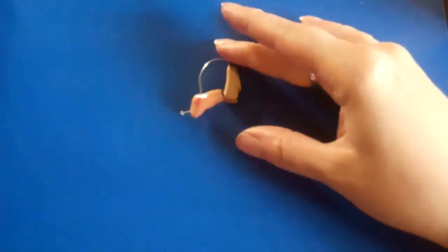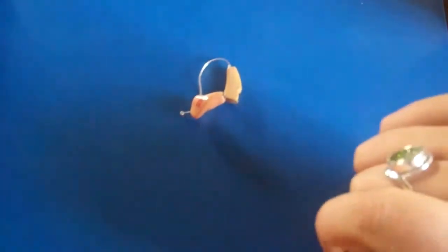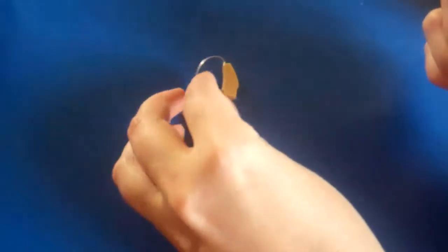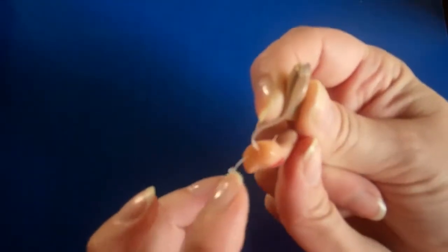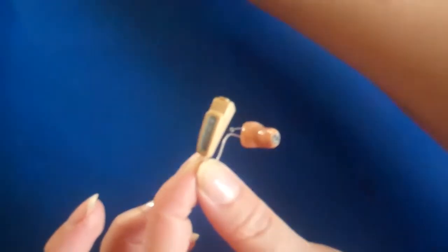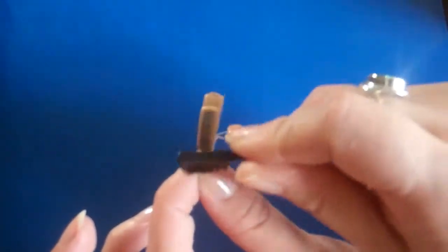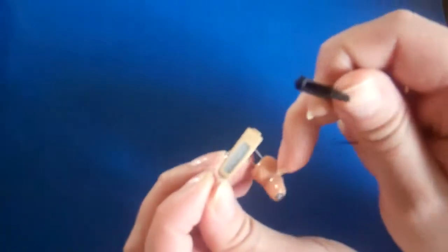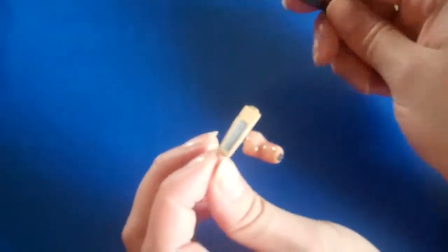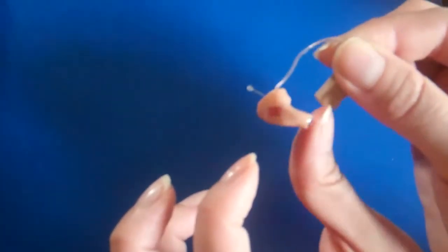All of these instructions will also work for your receiver in the canal hearing aid with a custom tip, with one small difference. The microphones for this tip are not here, but on the top of the piece that goes behind your ear. So you will use the brush to brush off those microphones back here and not on the back of the hearing aid. All the other tools can be used in the exact same way on the custom tip.